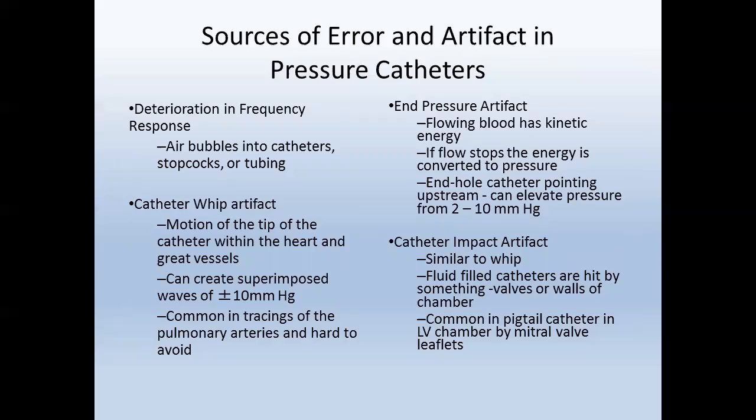The deterioration in frequency response is a fancy term, but if it looks very sharp and dampened, then think of air bubbles, either anywhere in the catheter, stopcocks, or tubing. Flush it, make sure you're okay.